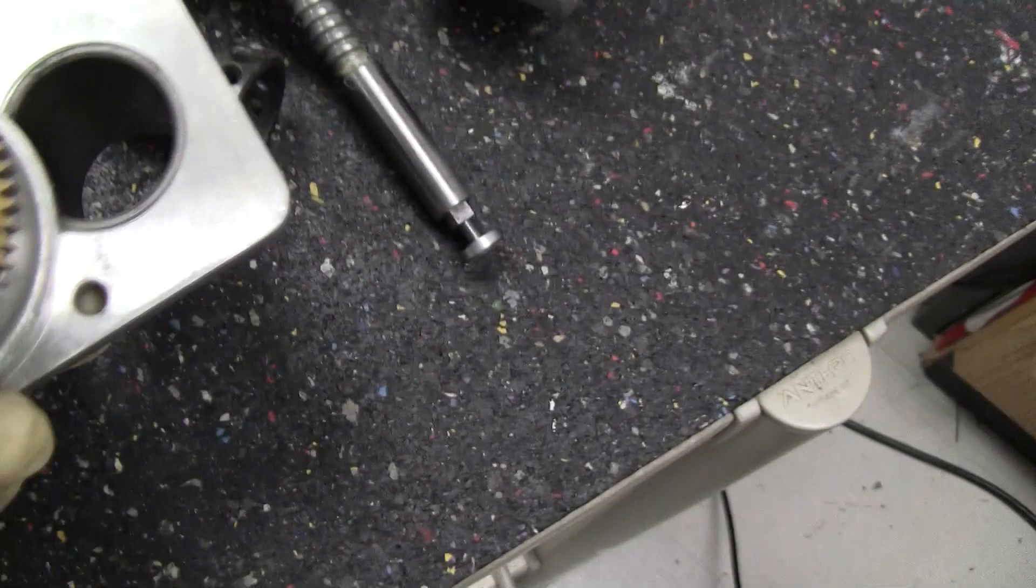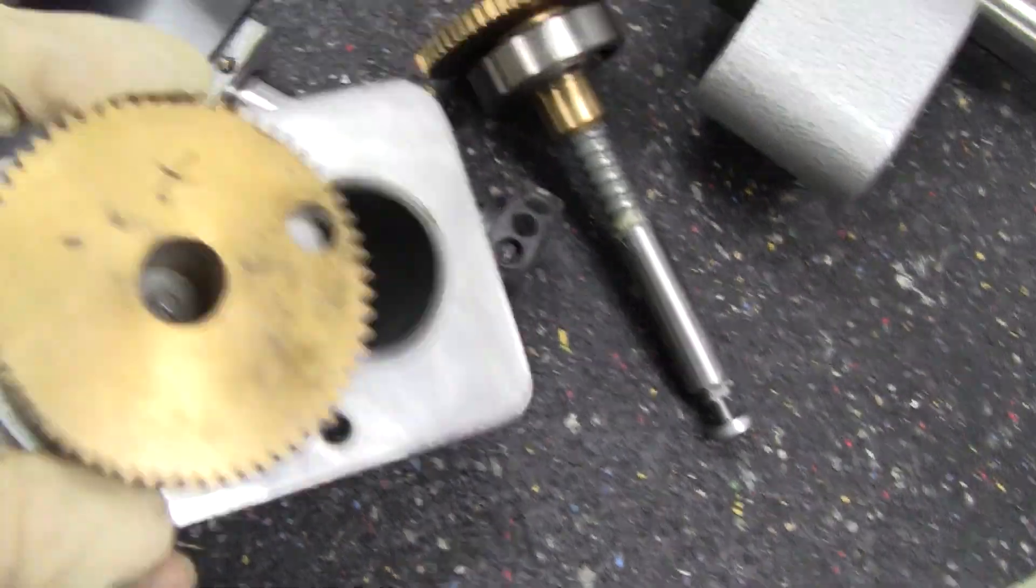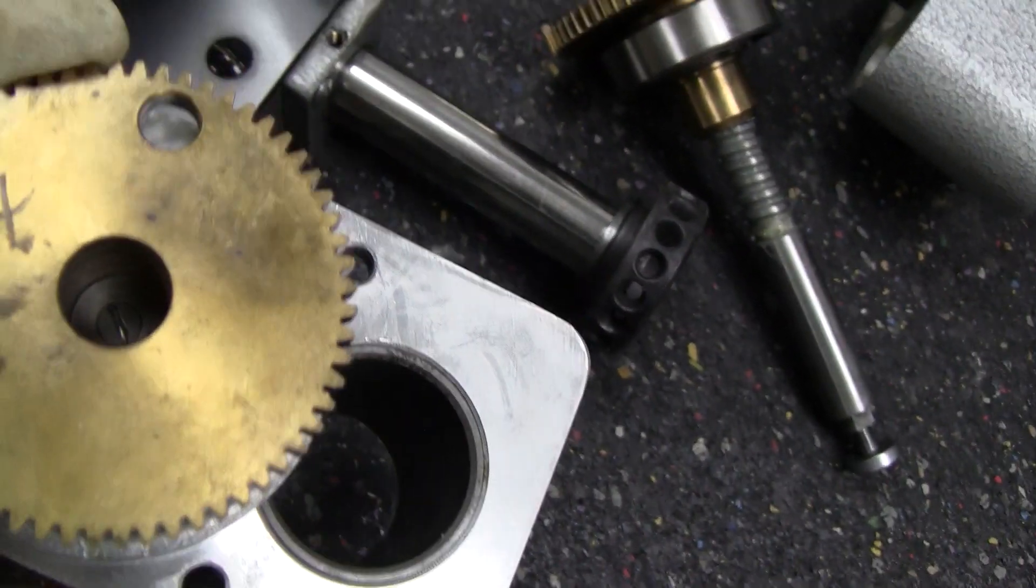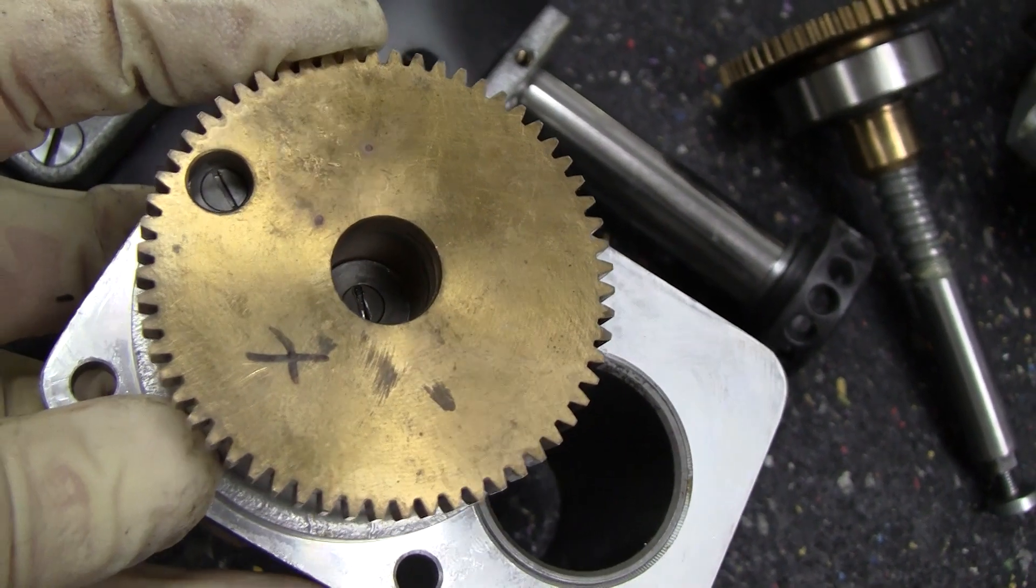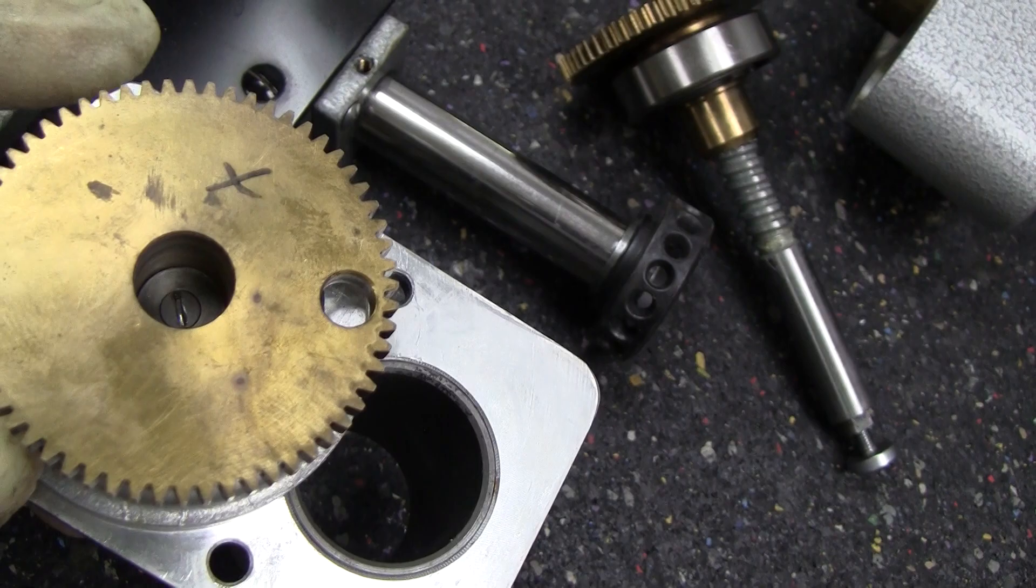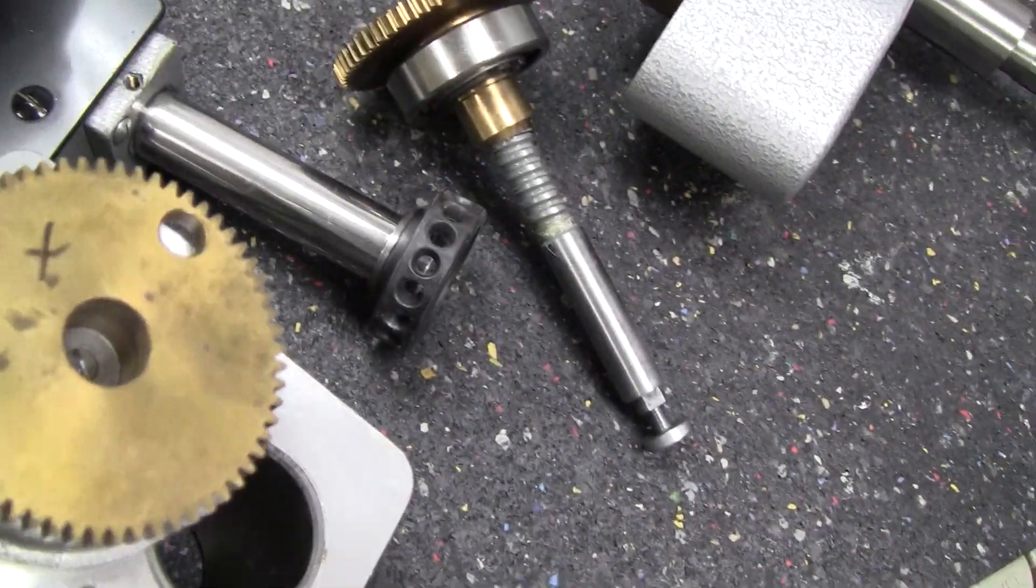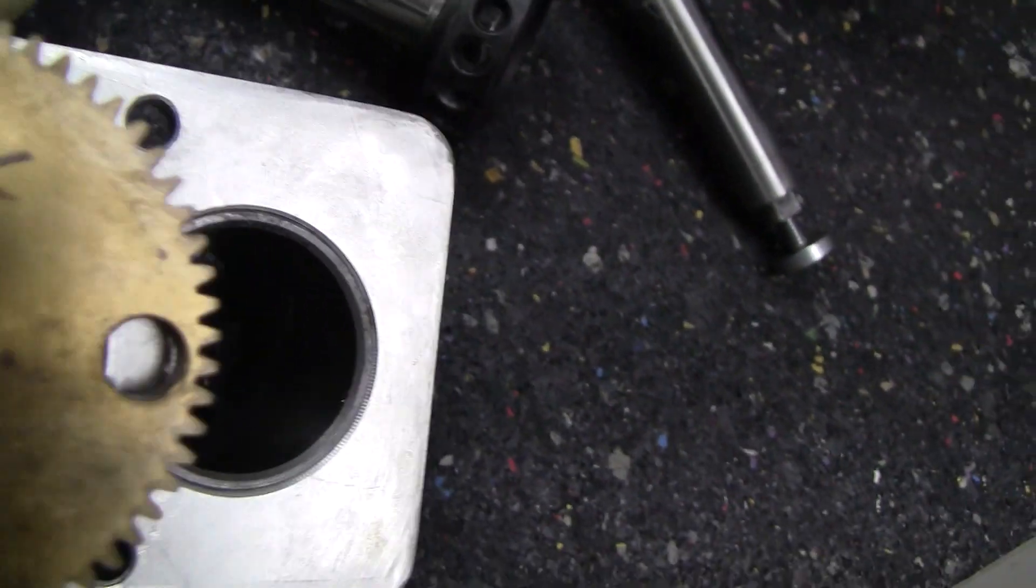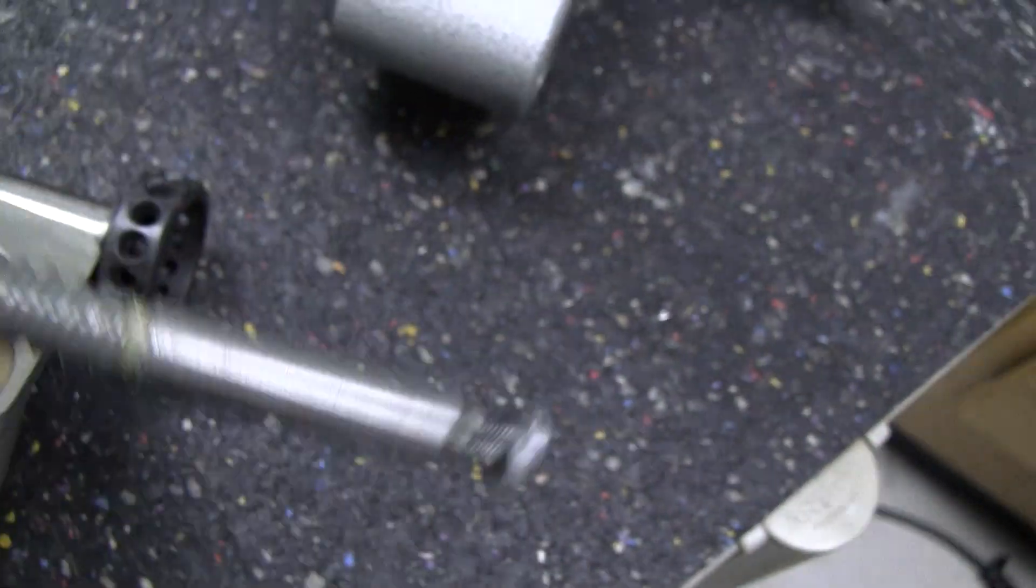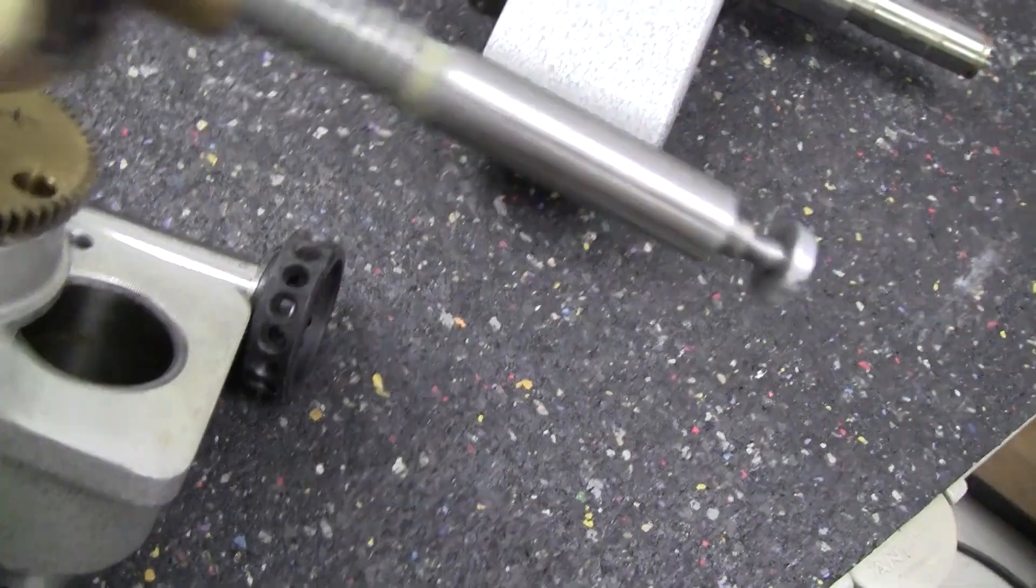It has three screws in here that you access through this little porthole. And there's three washers underneath those screws. Make sure you put those back in. Take all those out, and you also have a screw right in the middle of the spindle that needs to come out so you can get the whole shaft out.